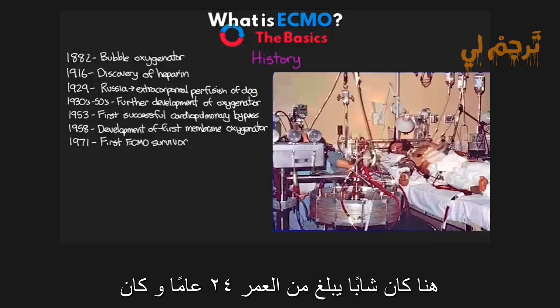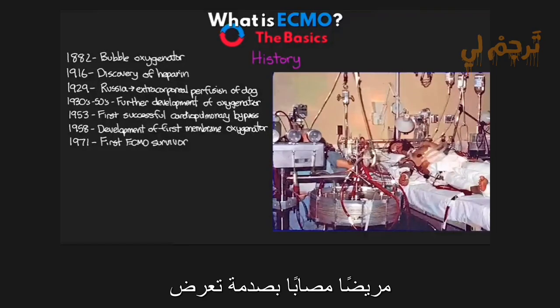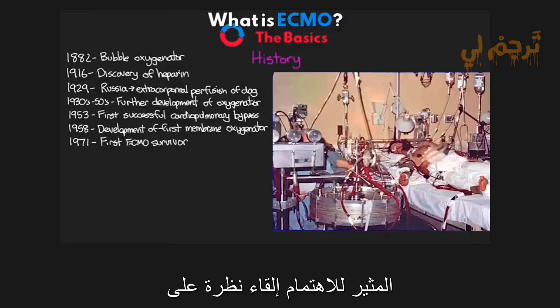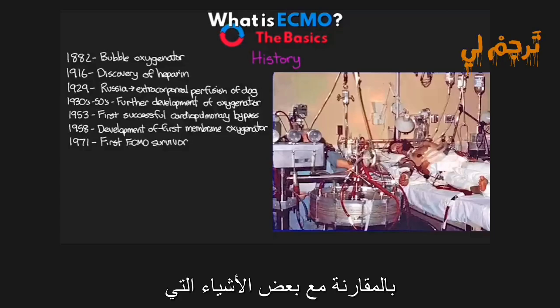He was a 24-year-old male that was a trauma patient. He was involved in a car accident. And I believe he spent almost 72 hours on ECMO, and he ended up surviving. It's kind of interesting to take a look at this contraption, especially compared to some of the stuff that we have here today.